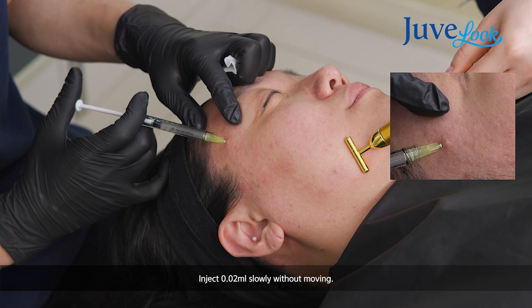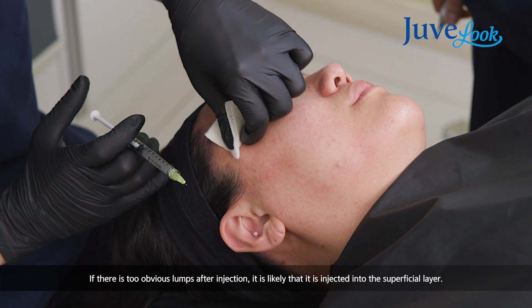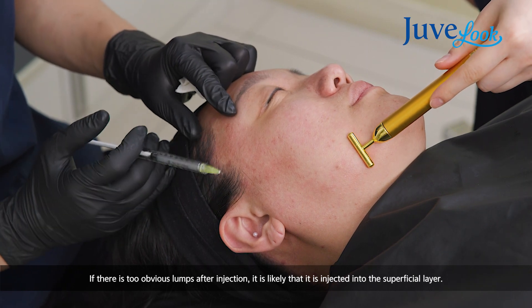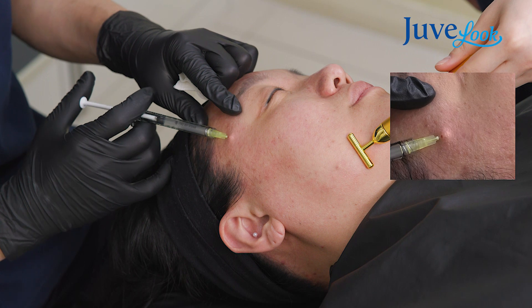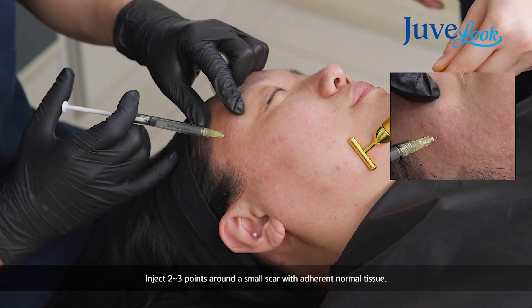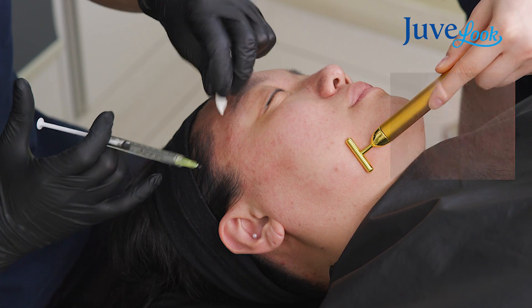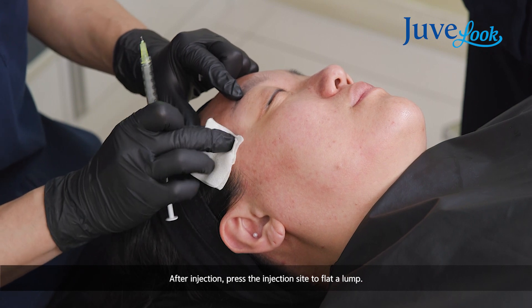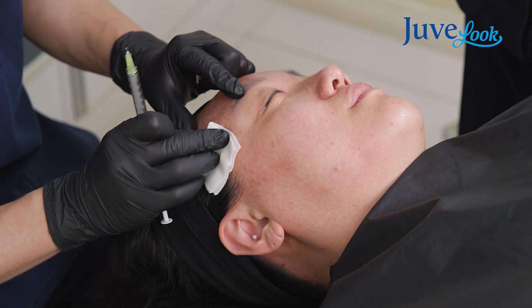Inject maybe 0.02 mL. And if there is too obvious a lump, that means your needle is located a little too superficial, so I recommend injecting a little deeper. Use 2 to 3 points per small scar, including the edges of normal tissue. After injection, you should press the scar to make it flat and flatten the lump.